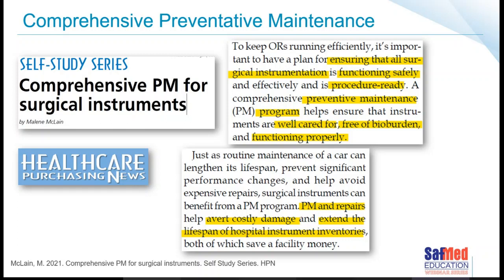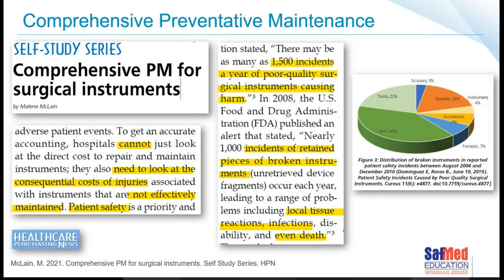If you don't have time every day of the week, maybe you can allocate some time on the weekends, as well as some form of Friday afternoon, somewhere where there's slightly quieter times. And if your surgeons are on leave, that's the time to tuck in and start cleaning your instruments and doing some more maintenance on them.